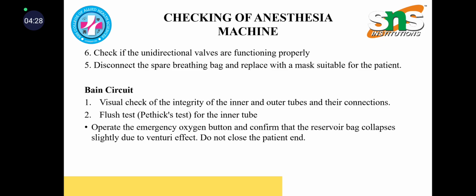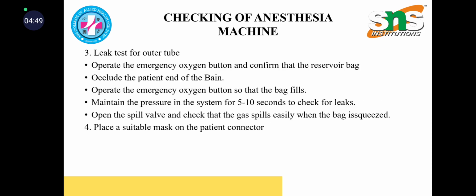Bain circuit. Visual check of the integrity of the inner and outer tubes and their connections. Flush test, Pethick's test. For the inner tube, operate the emergency oxygen button and confirm that the reservoir bag collapses slightly due to the Venturi effect. Do not close the patient end.